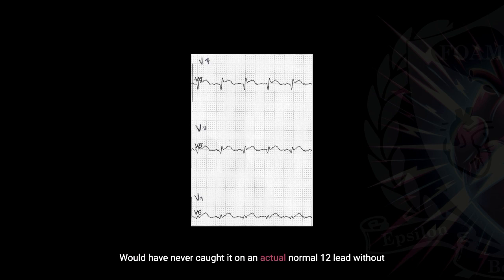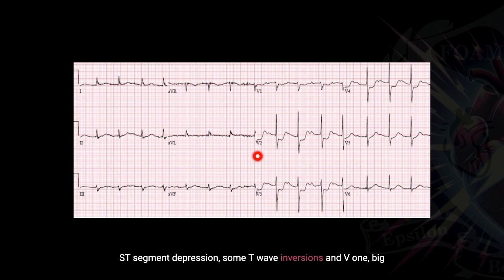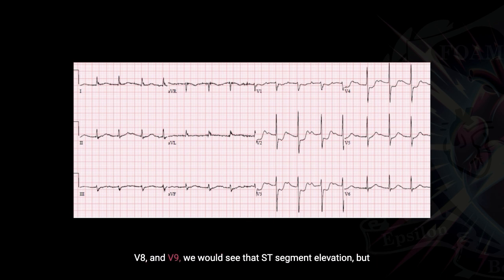We would have never caught it on a normal 12-lead without moving those leads back. What can clue you in is that massive reciprocal change we see in those anterior leads. Here's another great example — ST-segment depressions and T-wave inversions in V1, big-time ST-segment depressions in V2 as well as V3 out to V4. Again, if we put those leads on the backside of the heart — V7, V8, and V9 — we would see ST-segment elevation, but this will never meet ST-segment elevation criteria by itself.